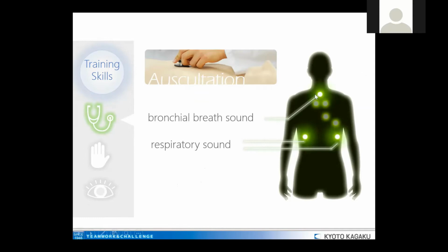So that's why in these 3 areas, we have included also speakers to hear the respiratory sounds. Only they are the normal cases. You cannot hear pathologies here because, you know, the main subject of the simulator is cardiology. That's why only normal breath sounds are included.